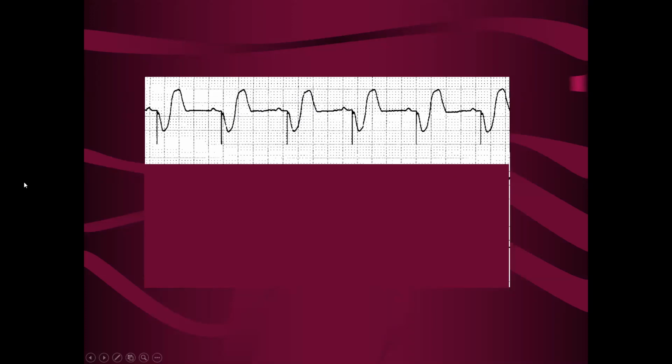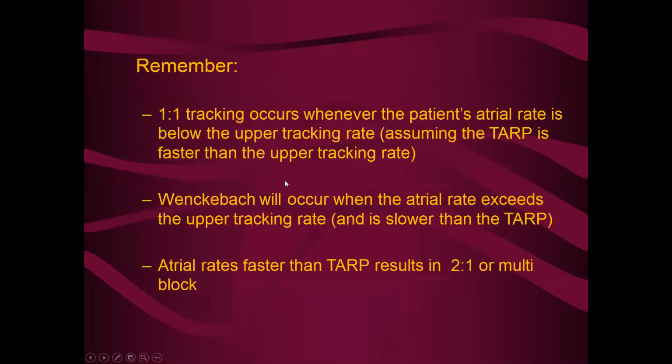But if the patient here previously was 160 beats per minute, and then here maybe going back to 170 beats per minute, then you've got to be suspicious that maybe the patient was having some 2-to-1 block in the pacemaker, and that's probably not a good thing for the baby. And so, if you see this kind of situation, it would be a good idea to call the pacemaker clinic or the fellow to do a check and maybe adjust some of those parameters.